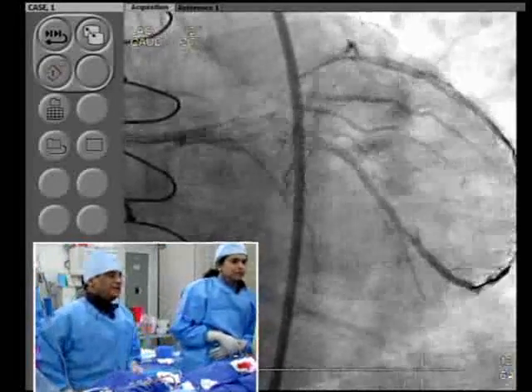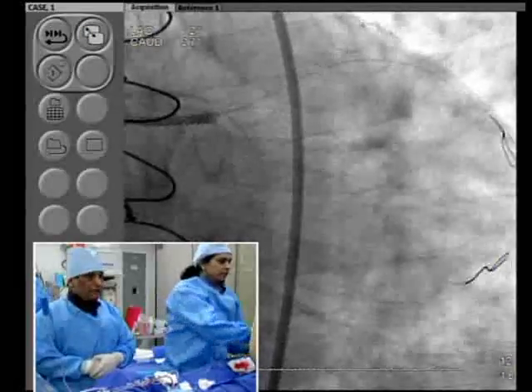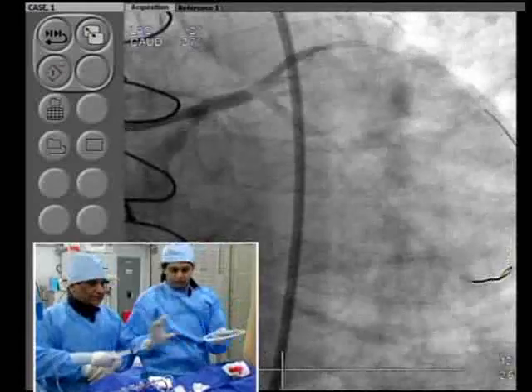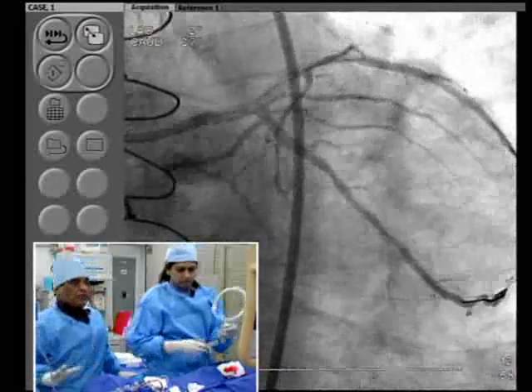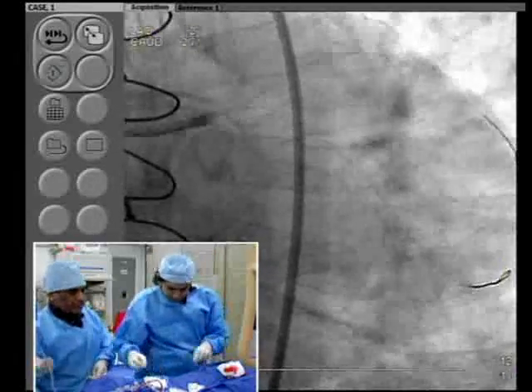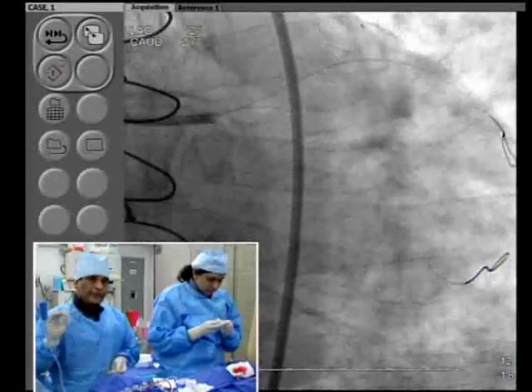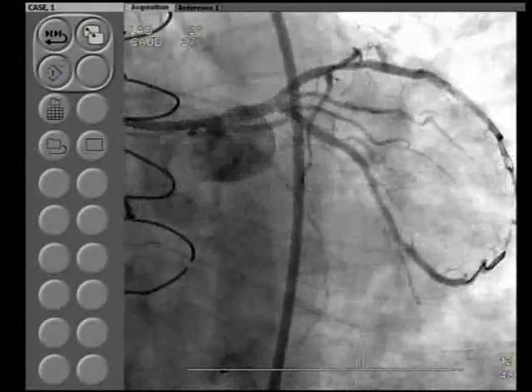Now, this actually, they call it OM, but I would say this is an LPL, a posterolateral branch. For coronary anatomy teaching, which we focus on very importantly every Thursday at Mount Sinai for our cardiology and intervention fellows, from 7:15 to 8 o'clock every Thursday. The only exception is if it is a holiday or during the symposium, but the remaining 48 or 49 Thursdays of the year we have the coronary anatomy round, during which we ask our cardiology fellows, and many times even nurse practitioners, and in a complex case our interventional fellows, to read an angiogram and go over the anatomy.